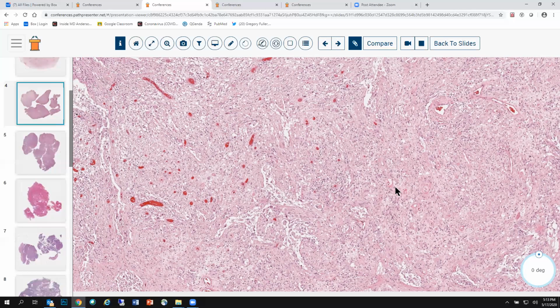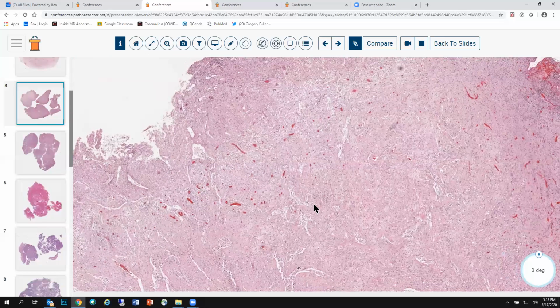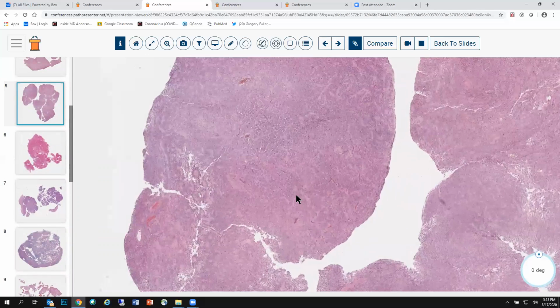Now, of course, they can occur in older individuals. They can occur certainly outside the temporal lobe, frontal lobe, etc. But all of these features will help you so much if you behave as a physician and know all the clinical information. I have other lectures on that we could talk about. Remember, BRAF V600E is the most common driver mutation for ganglioglioma. So this was a nice classic case. All right, moving on to the next unknown number 5.